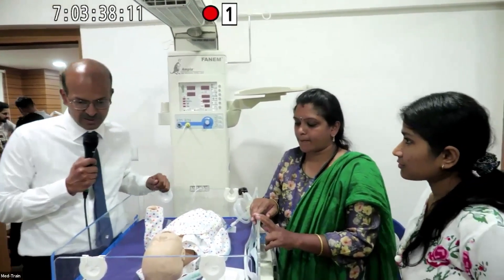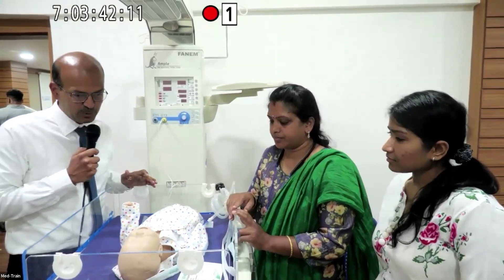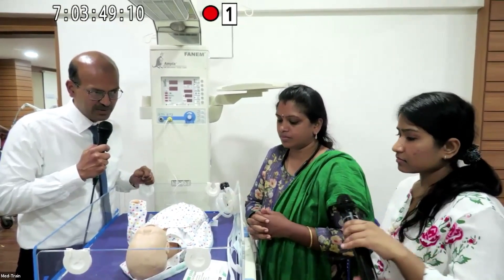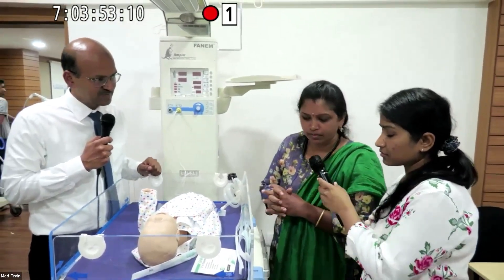This is a demo from the NACU team at Manipal Hospital, Dr. Karthik's unit. We are here for a quick demo of suctioning and precautions, following an earlier discussion on suction.